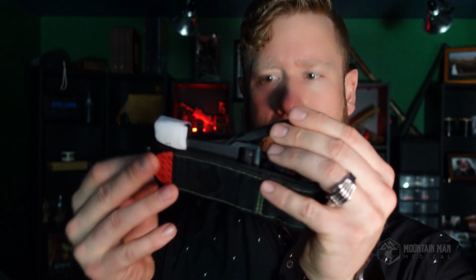And then the next thing that kind of pops out to me is they've got a aluminum, feels aluminum. I think it's, yeah, this is metal. It's got a metal windlass, and that's kind of nice. A lot of people don't like the cat tourniquet because they are afraid that the plastic windlass will break. So they have upgraded it on the Recon to make sure that that's not an issue. So if that's something that you don't like about the cat, Recon might be a good option for you.